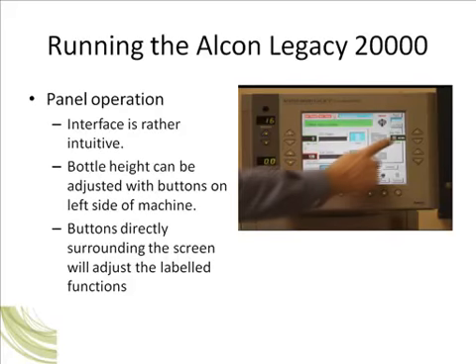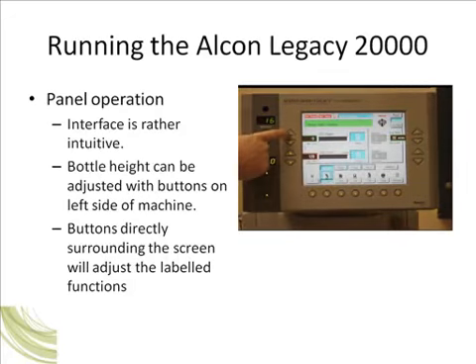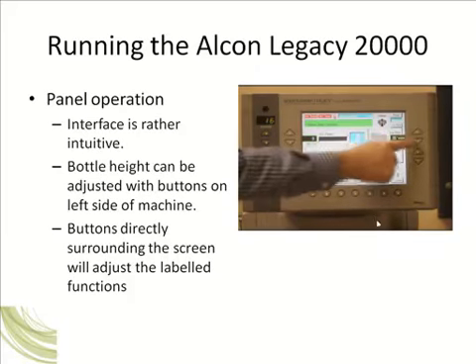Because this video is running somewhat slowly, we'll move along using a mouse. To switch between the different modes such as vitrectomy, ultrasound, IA, linear coagulation, you press the buttons along the bottom of the screen or the icons on the screen directly.